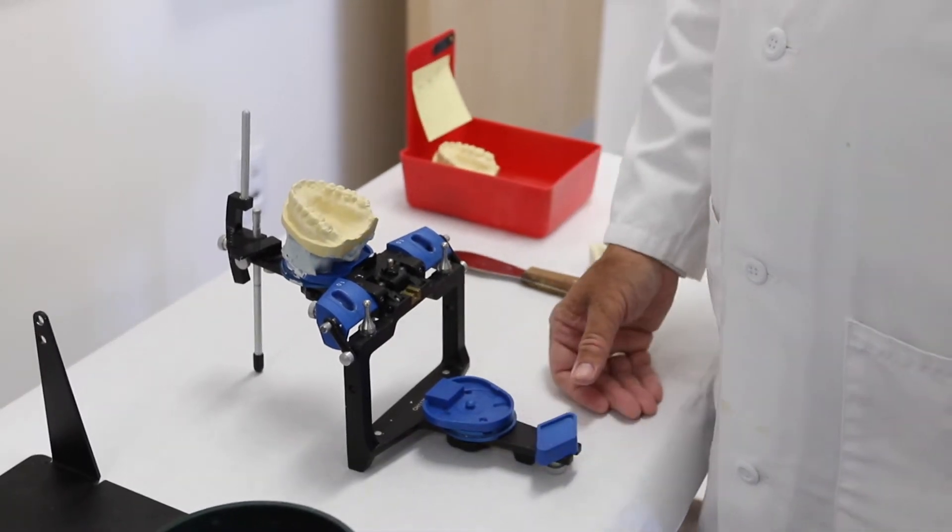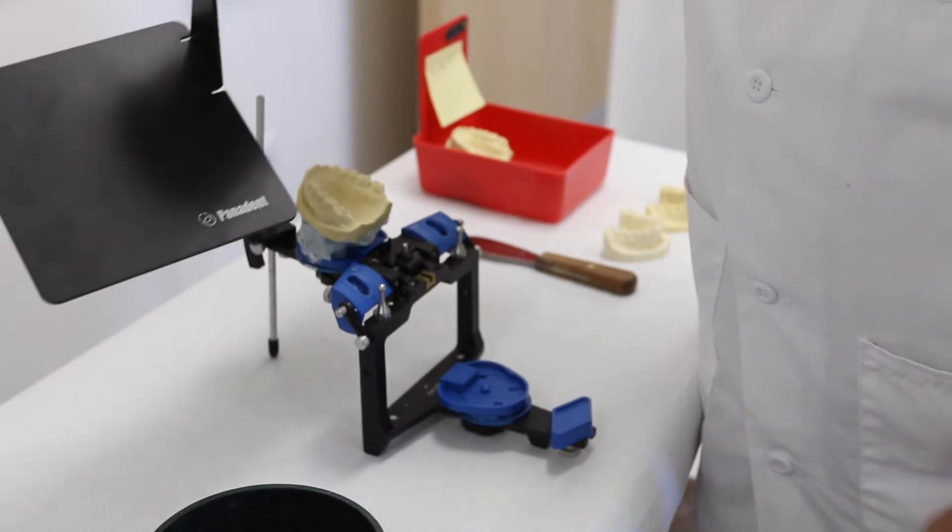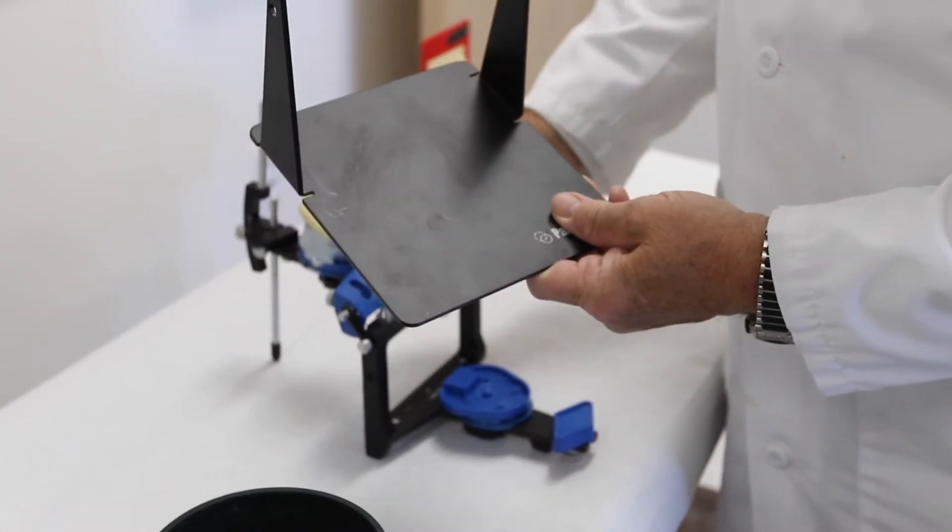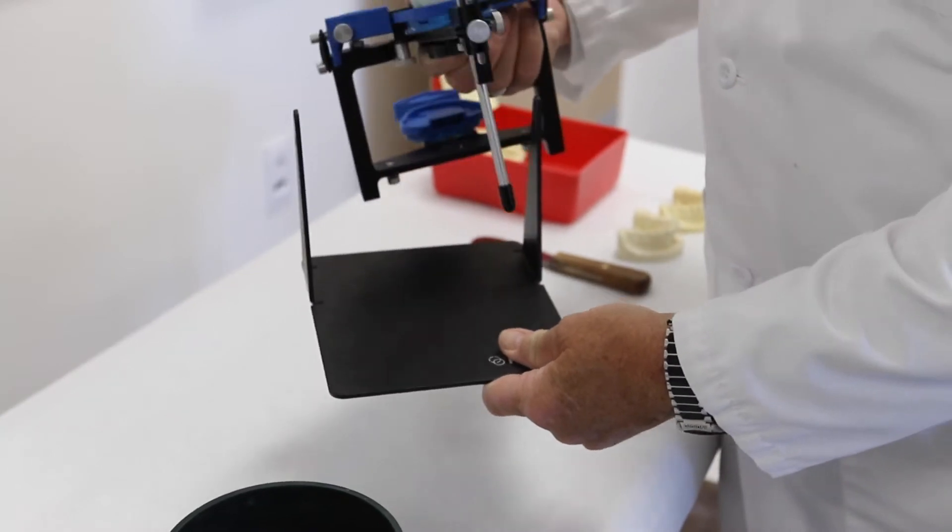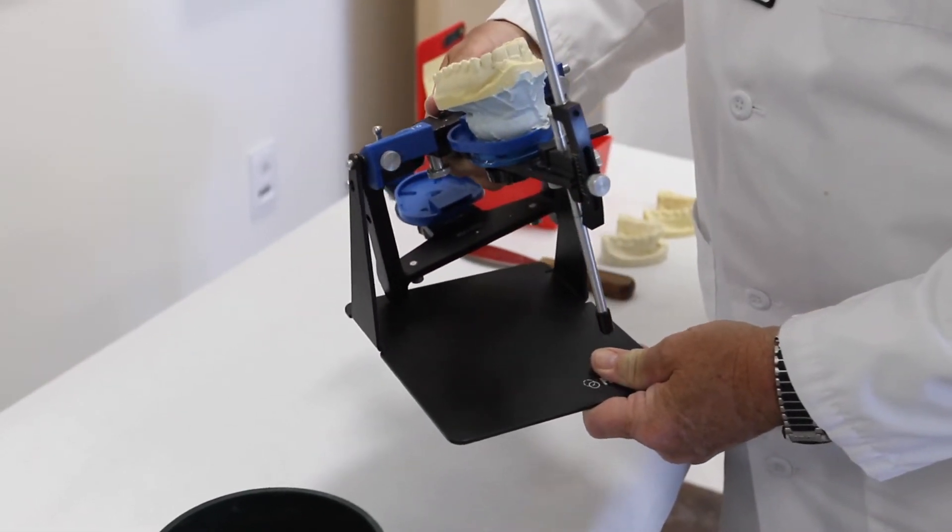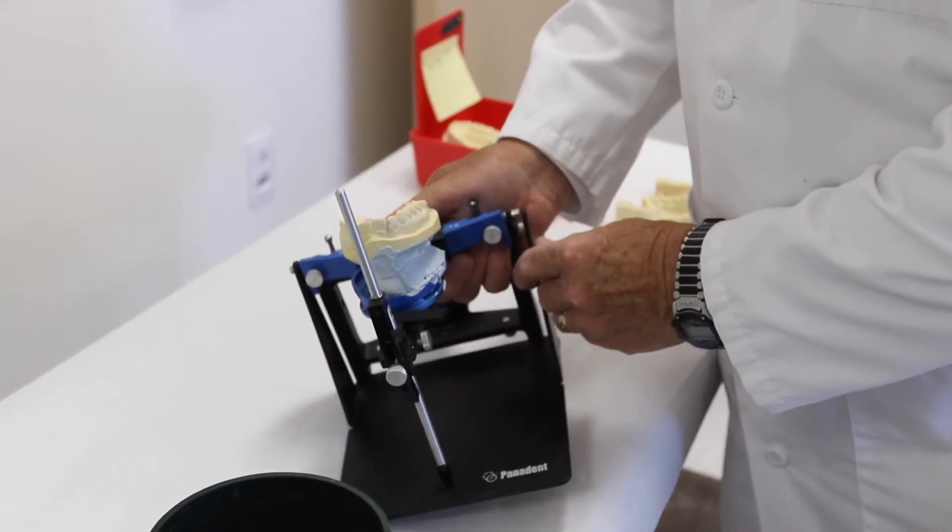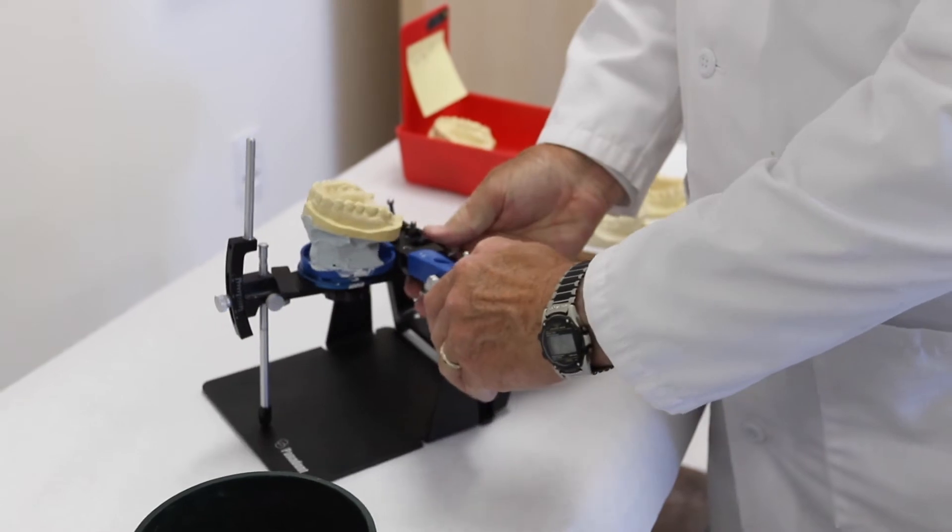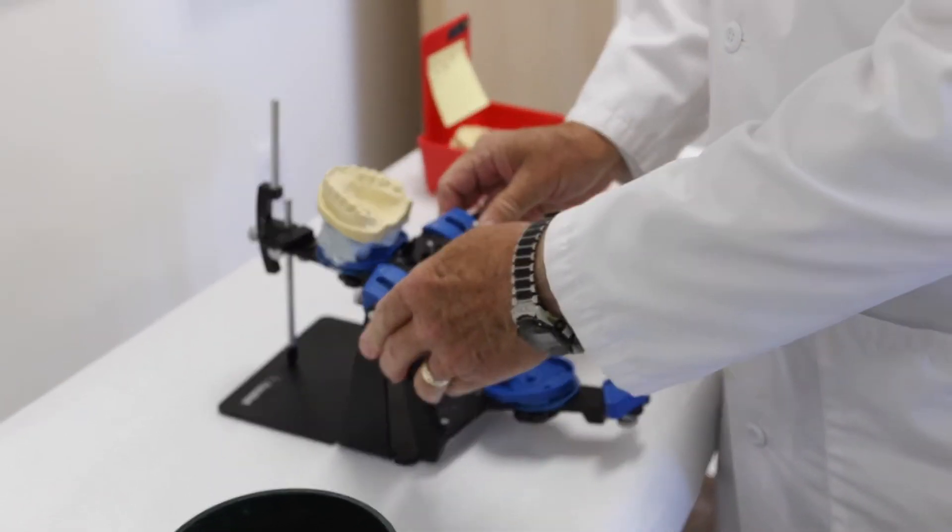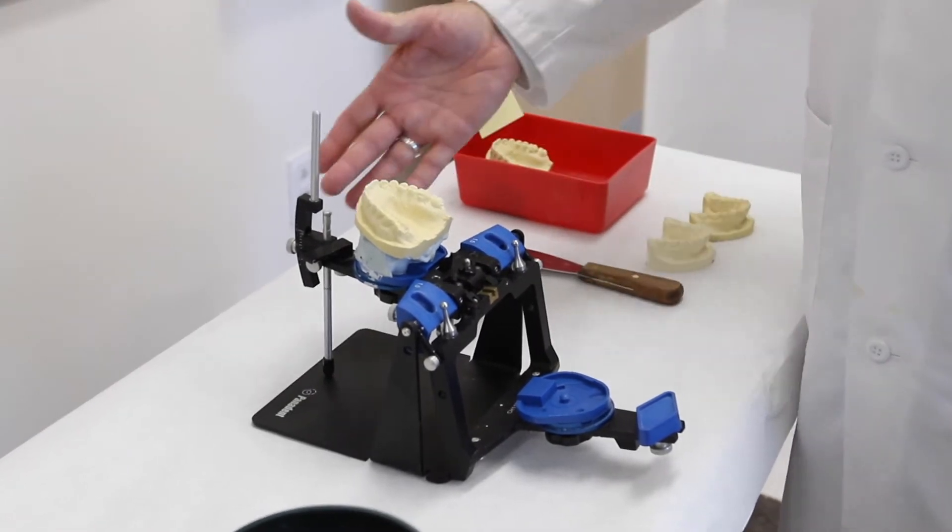At this point now you need to incorporate the use of the mounting stand. You do that by taking the model and carefully on the articulator, carefully engaging the pin by the analog at the condyle area, fossa area, and also on the other side.